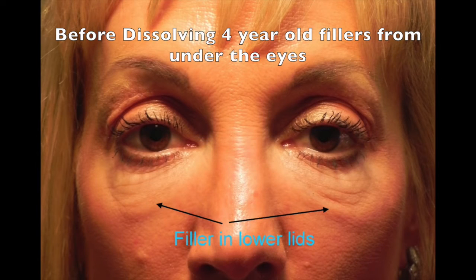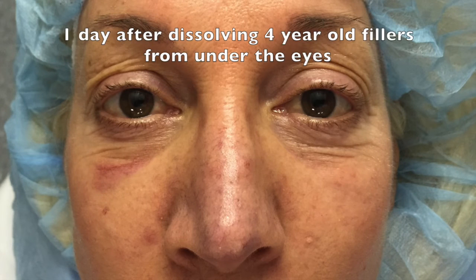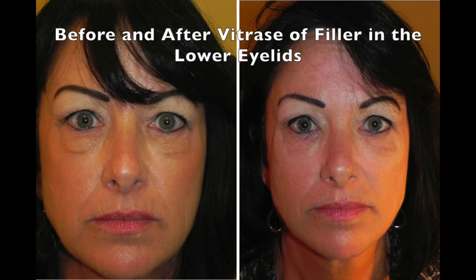Once again, this was the appearance of the patient with the fillers in the lower eyelid region before dissolving them. This is the patient one day after dissolving the filler with the hyaluronidase. This is a preoperative photo where she was going to have lower eyelid fat manipulation and tightening of the skin with laser skin resurfacing. This is another example of irregularly placed hyaluronic acids in the lower eyelids.